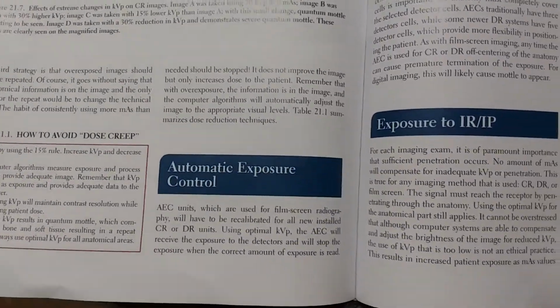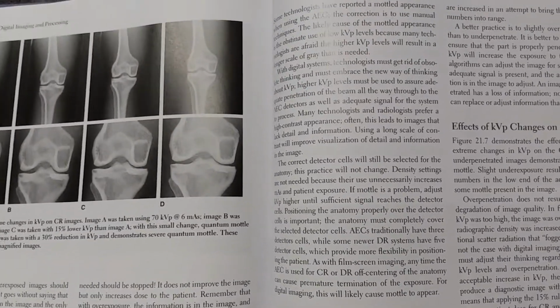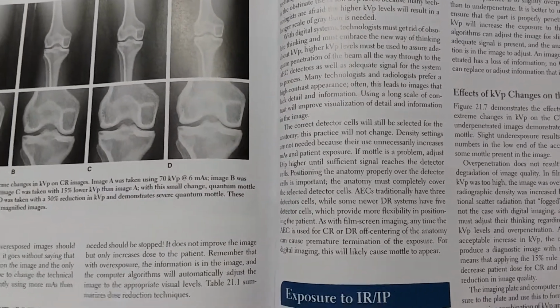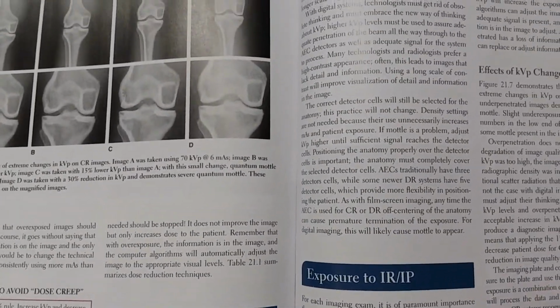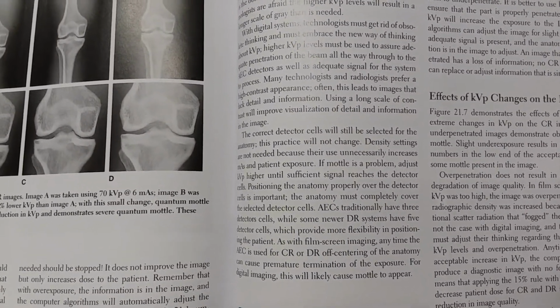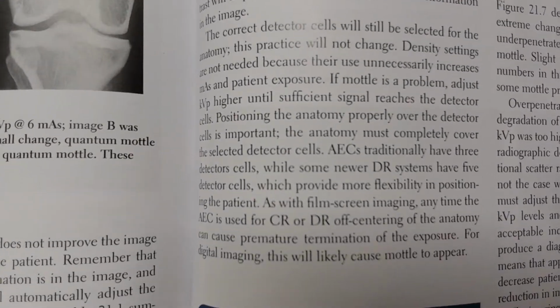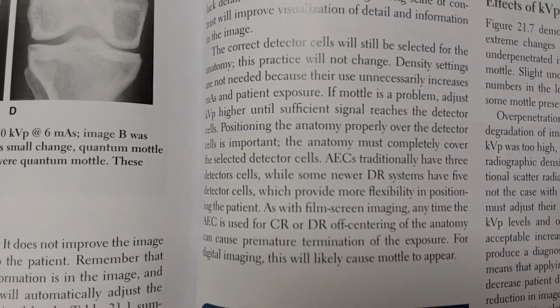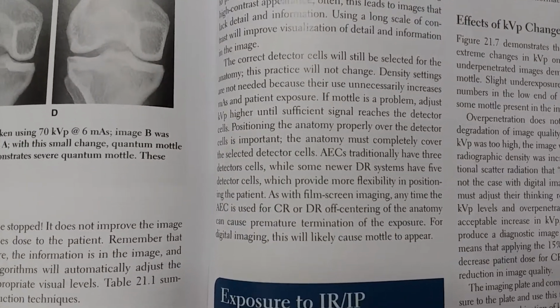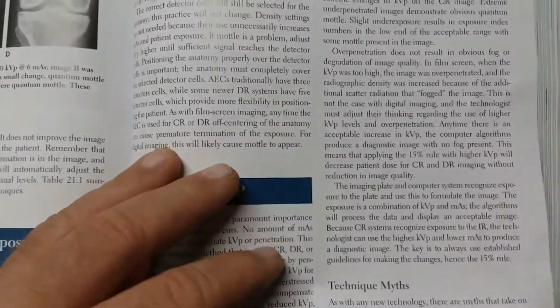All right, automatic exposure control, of course, can still be used, which means you're using a grid because you're doing it through the table system, rather than tabletop. And when you use the grid and the automatic exposure control, it's important that you do use sufficient kV to penetrate the part adequately, or you won't get a sufficient image, and also to position over the correct photocell, detector cell, which it talks about in that paragraph, in order to avoid premature cutoff of the exposure, as it says there. And then exposure to the IR and the IP, I'm going to skip that.